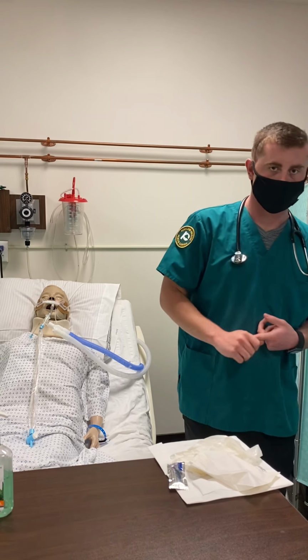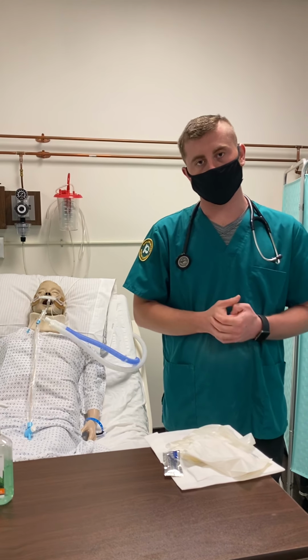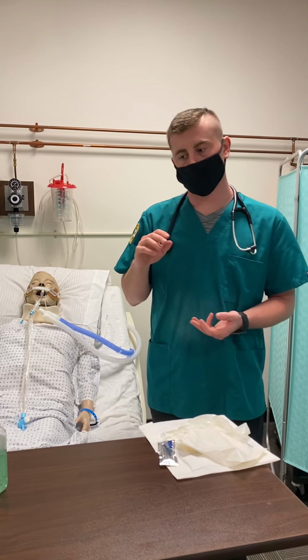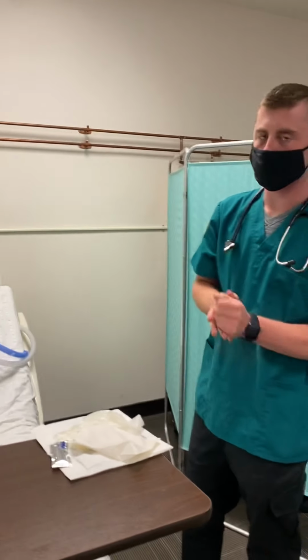First, I'll review the physician's orders as well as assess the patient's chart. Following that, I will gather my equipment and perform hand hygiene. And then I will proceed to introduce myself to the patient.